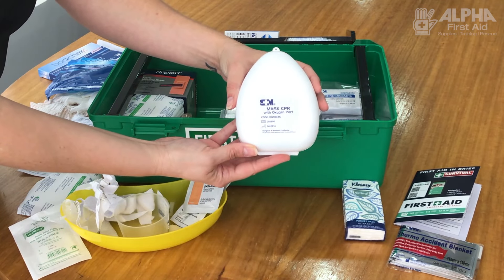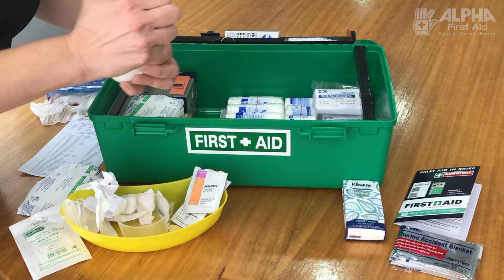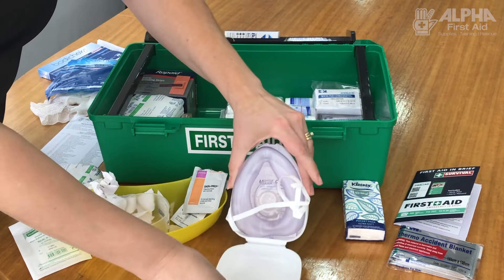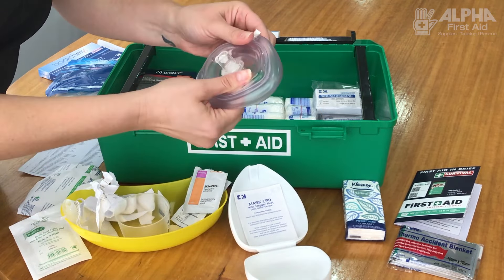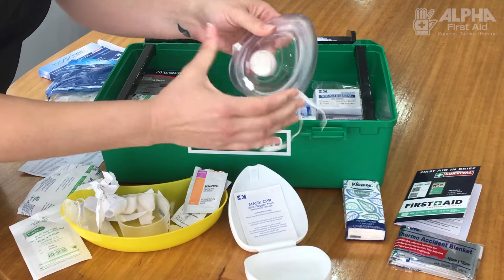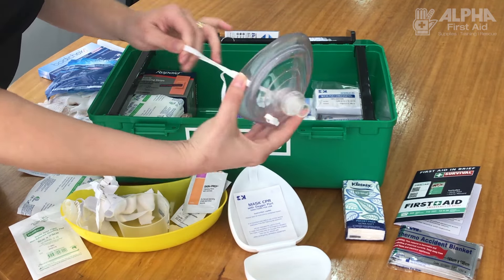Resuscitation mask — extremely important in a first aid kit. This one is a full CPR mask, which means it's going to seal the face very well. It also has a filter, which means you won't have anything regurgitated back if your casualty starts to regurgitate.